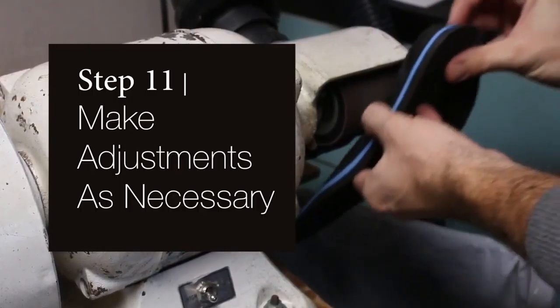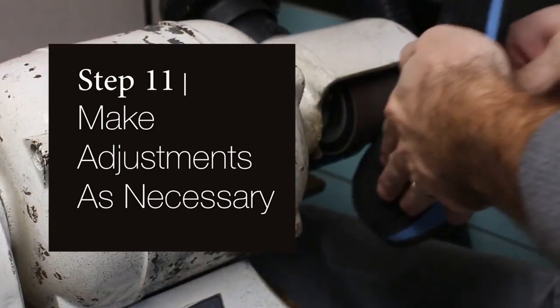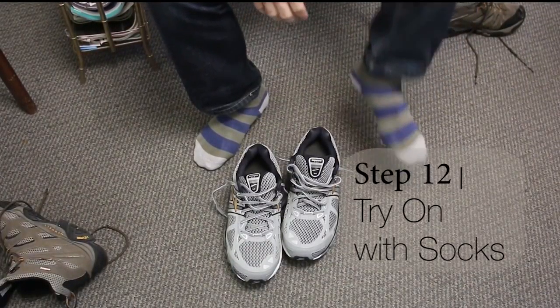Step 11. Make adjustments as necessary. The patient may feel problem areas, which you may want to address by grinding or smoothing with a Dremel or grinding wheel. Step 12. Try on again with socks.